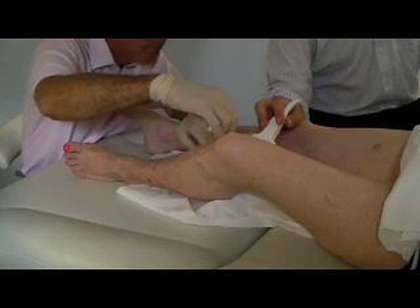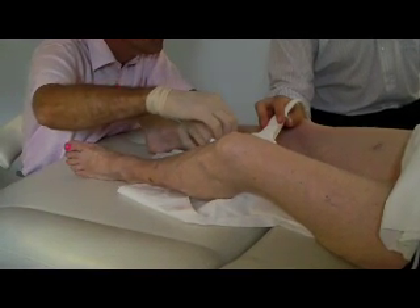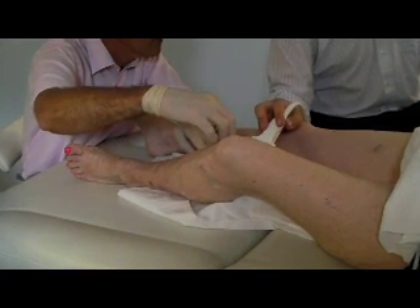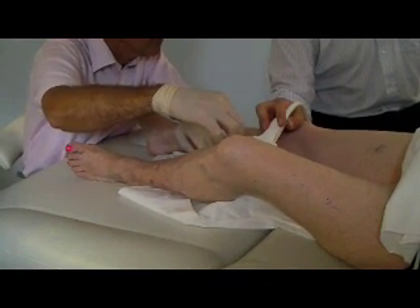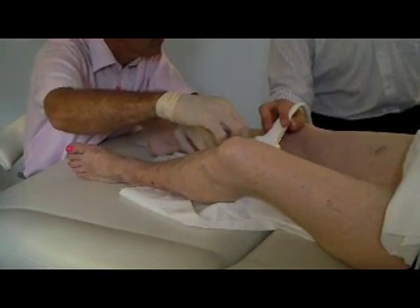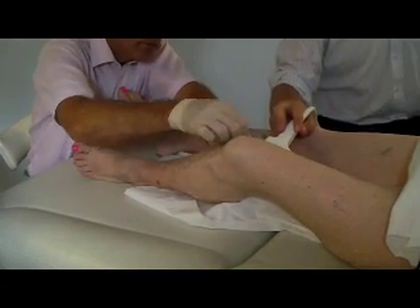The doctor is able to place the needle precisely into the centre of the vein using the ultrasound. That's why in this video the doctor keeps looking up to their left hand side where they're looking at the screen of the ultrasound machine. In this clip the ultrasound machine is being held by a vascular scientist, but the procedure can be done with one doctor doing both the scanning and inserting the needle.